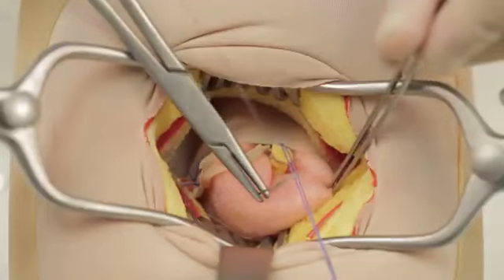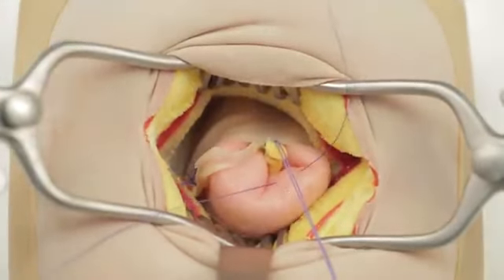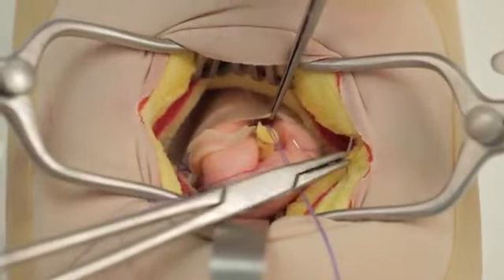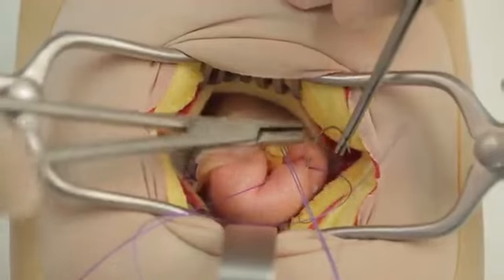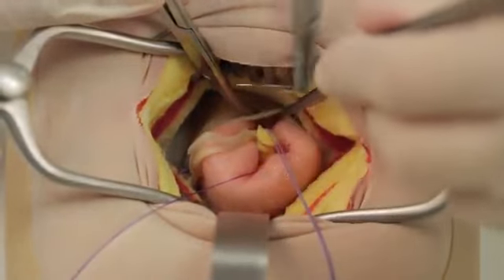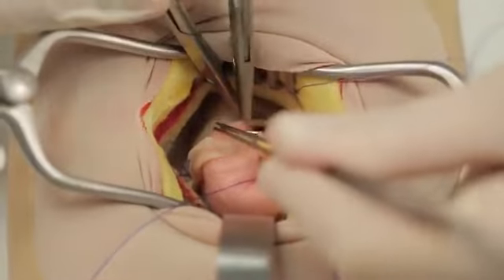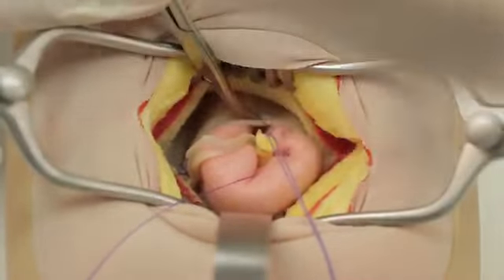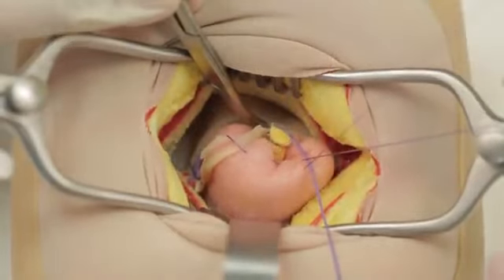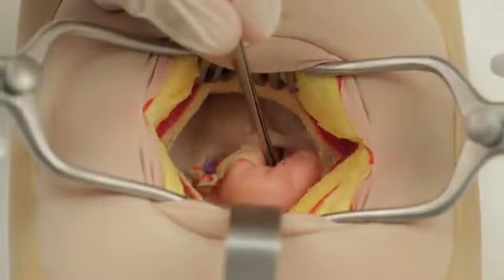Insert a seromuscular purse string suture of 2-0 PDS or similar material on a round-bodied needle encircling the appendix base. Ask your assistant to push the appendix base using non-toothed forceps whilst you tighten the purse string to bury the stump.